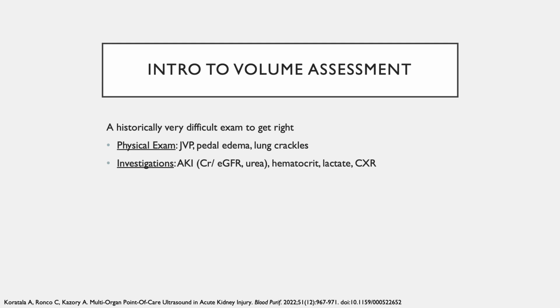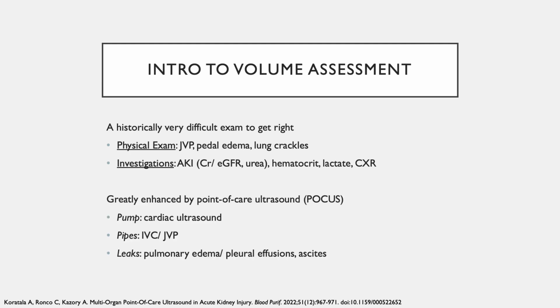As previously discussed, the volume assessment, and by extension, the focused physical exam, can be difficult to perform and interpret accurately. Findings on physical exam and investigations can certainly help, including those listed here, but in this talk, we'll focus on integrating POCUS into that assessment.